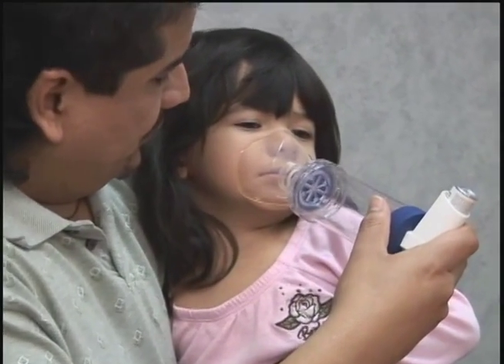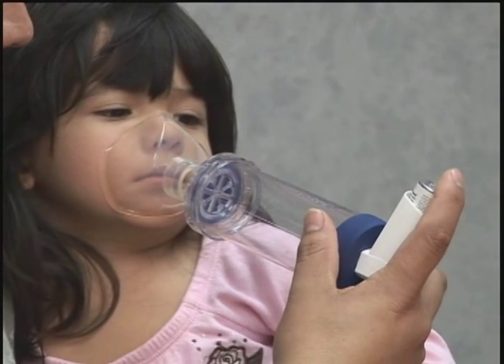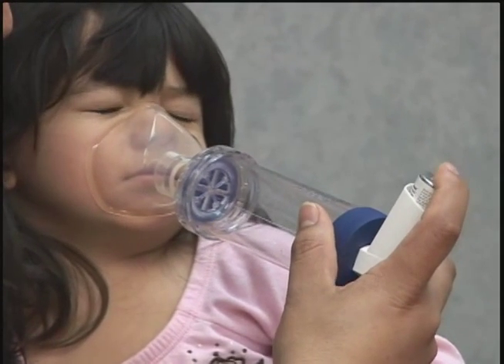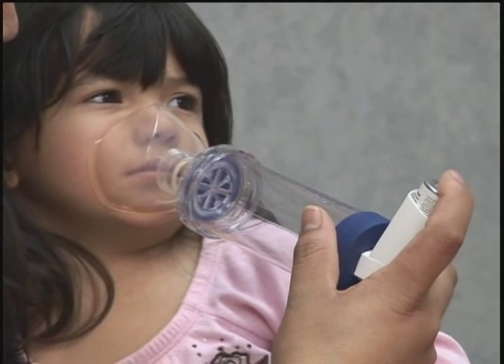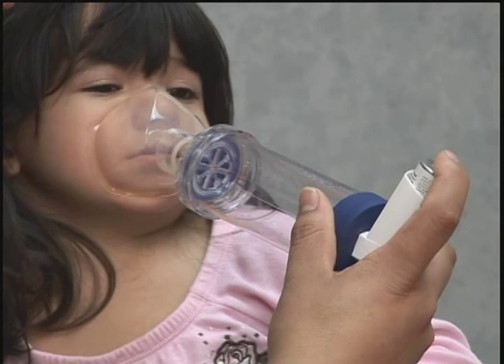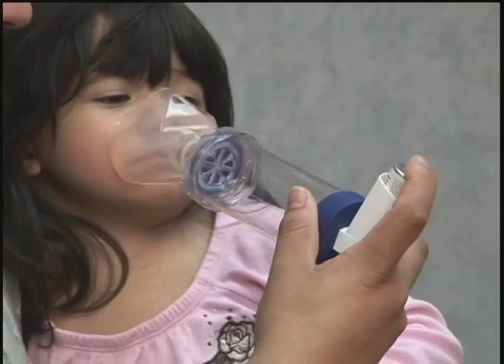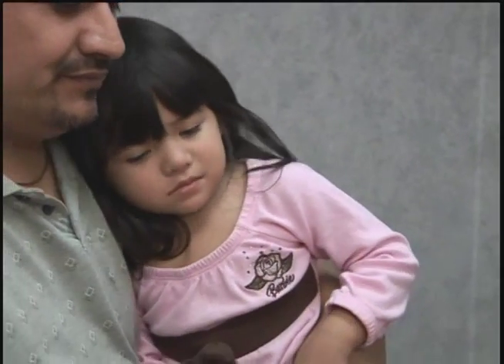Make sure that the mask is in close contact with the face, but do not press too hard. As your child is breathing out, press down once on the inhaler. Keep the mask pressed to the child's face until they take five or six breaths.